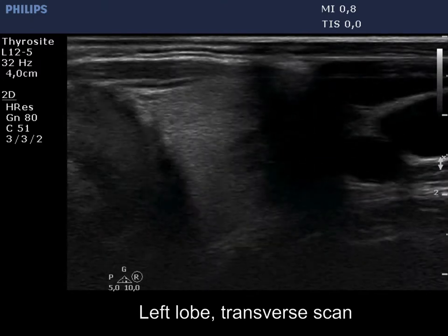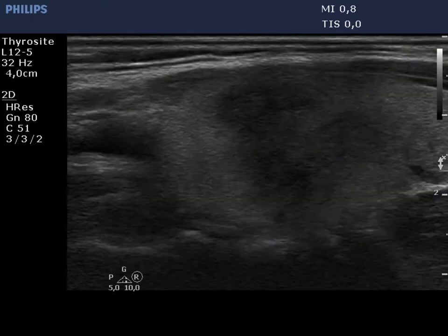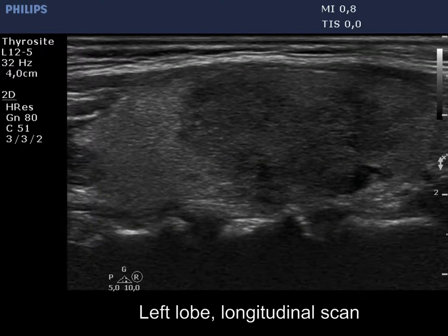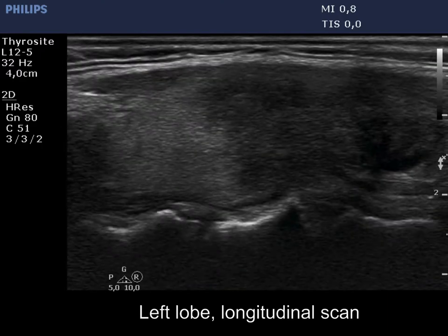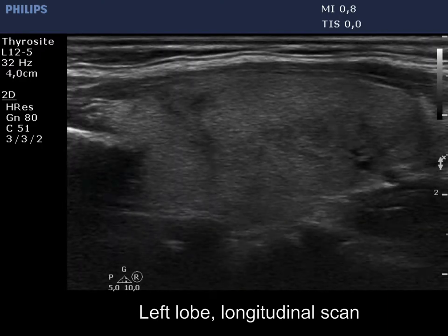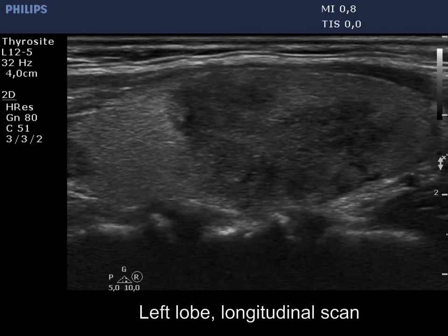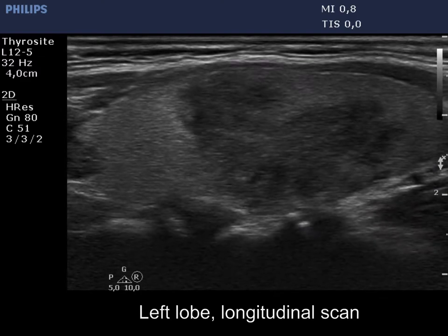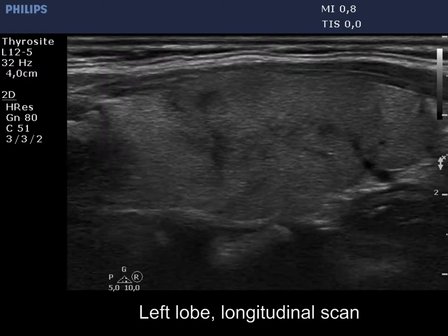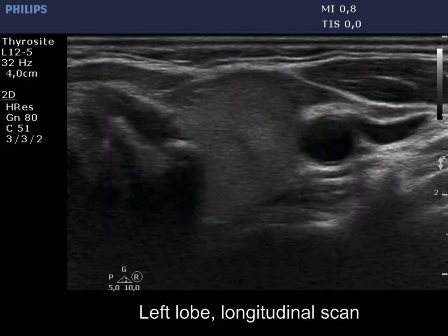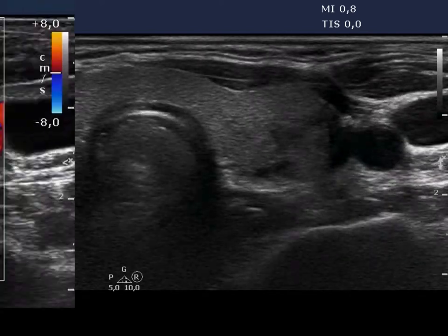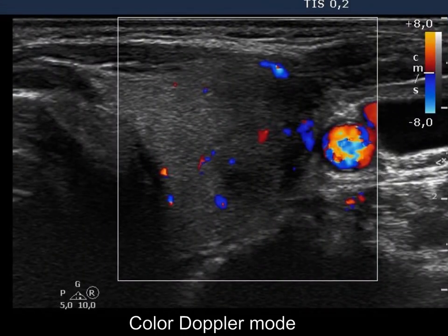On the other hand, the left thyroid became painful, and the proportion of the hypoechoic lesions has increased. The borders are lobulated, while the vascularization was decreased in this lobe.